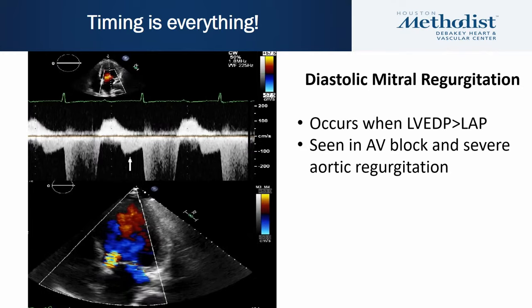Diastolic mitral regurgitation occurs when MR happens in diastole — seen on Doppler tracing when LVEDP exceeds left atrial pressure. This phenomenon is seen in AV blocks and severe aortic regurgitation.